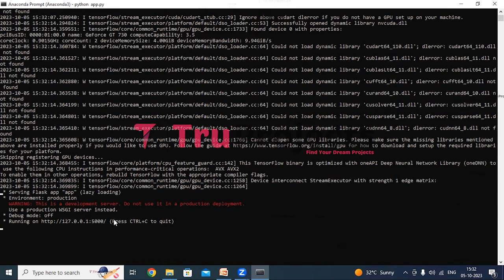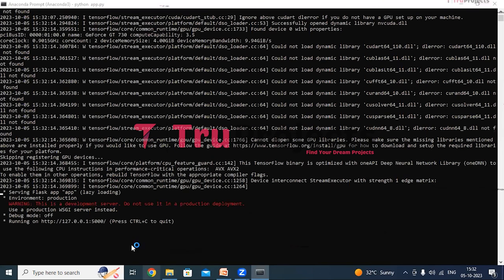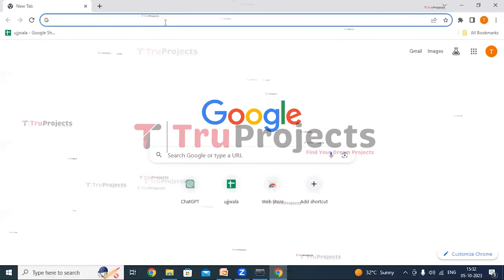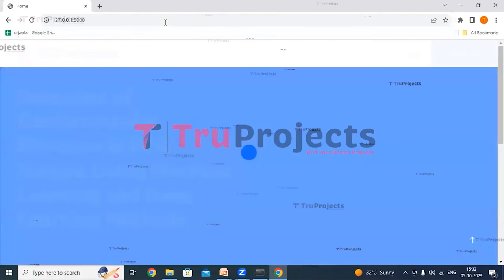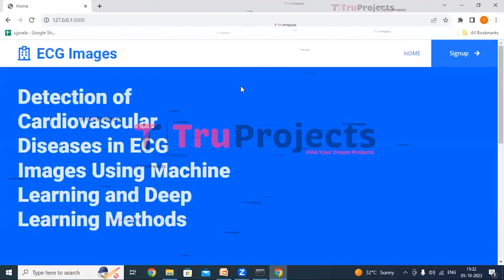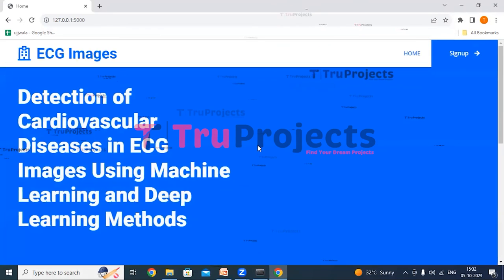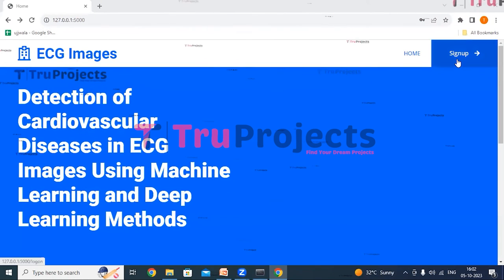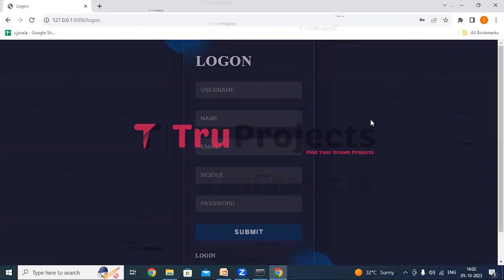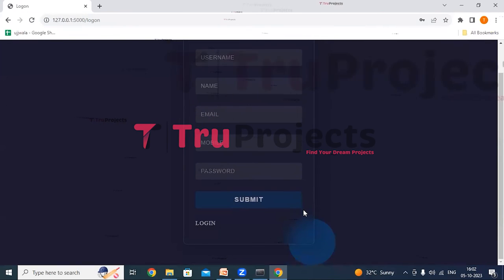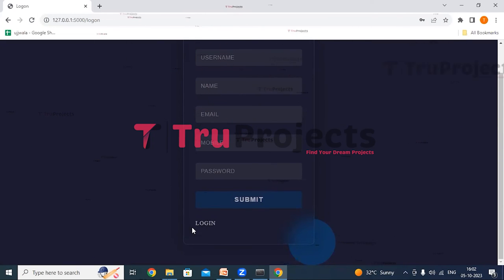Copy the local link provided by the framework and paste it into any web browser. The home page of the project has been displayed in the browser — this is the front-end built using Flask Framework. There is a signup link visible. If you are a new user, you need to register first by filling in all details and clicking the submit button. If you already have an account, you can directly log in by clicking the login link.